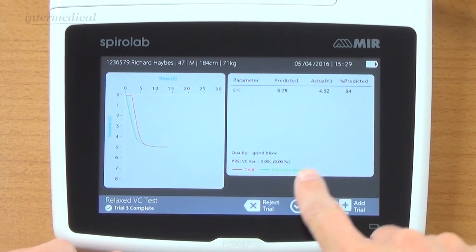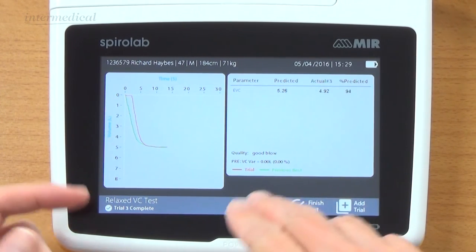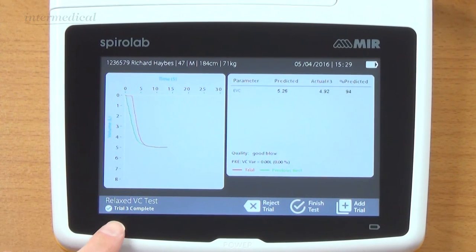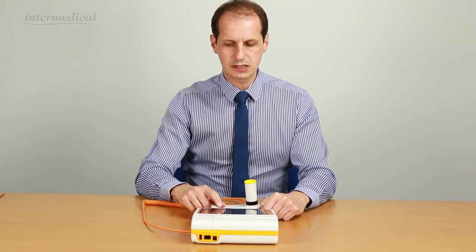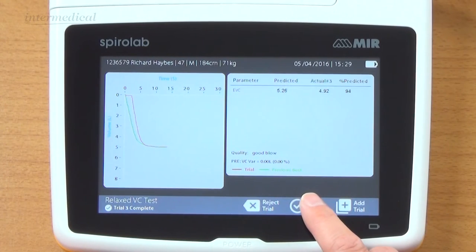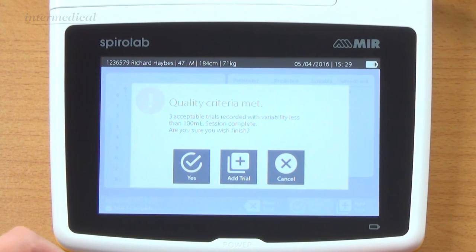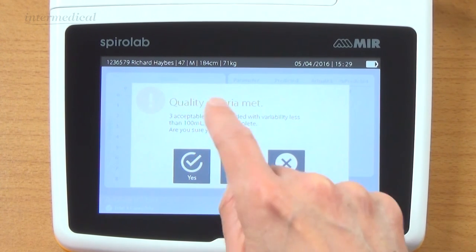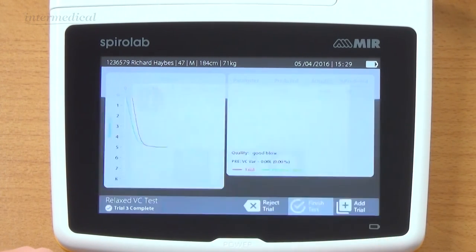We've got my third test now. Variance was 0.0 litres, 0% - it was identical. You can see the graphs are pretty similar. Percent predicted comes up, and down here it's saying trial three complete. We can now finish the test. Clicking finish test, it says we've got three acceptable trials with variability less than 100 mils - session complete. If it didn't say that, it would tell you if there was a huge variation and you could click add trial. But I'm going to say yes.